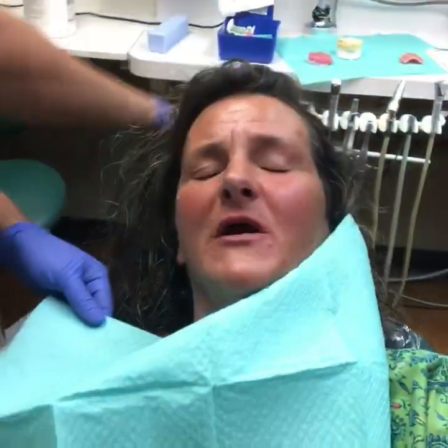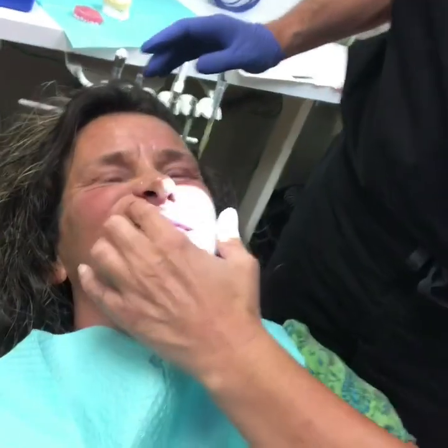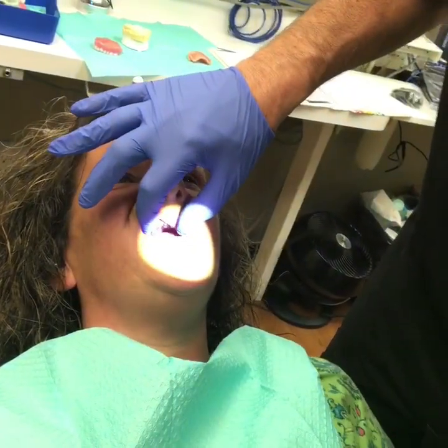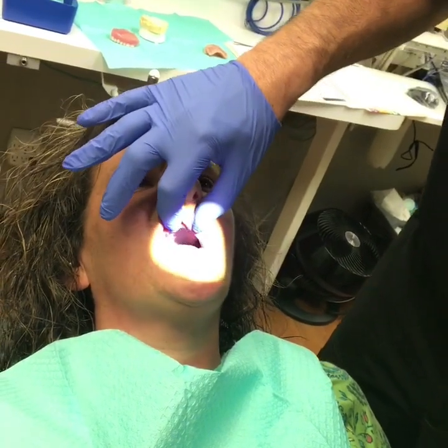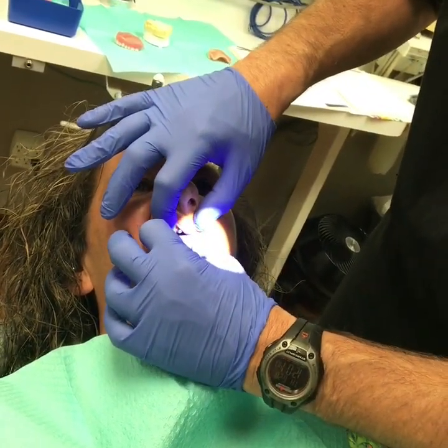Oh, you got some good stats. Most of them come out really easy. There's one that... It's that one, isn't it? Yeah. Any of the implants, any problems with them? No. Now, there's one over here. Yeah. The gum irritates sometimes. Yeah, this one right here? Uh-huh. I'm going to try to pop them. Ready?